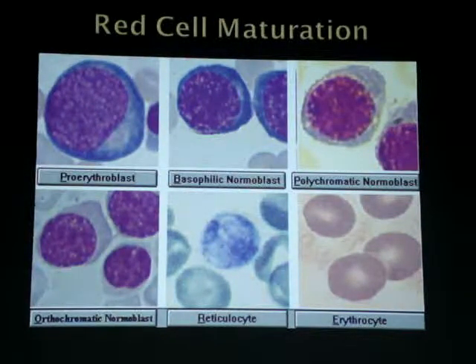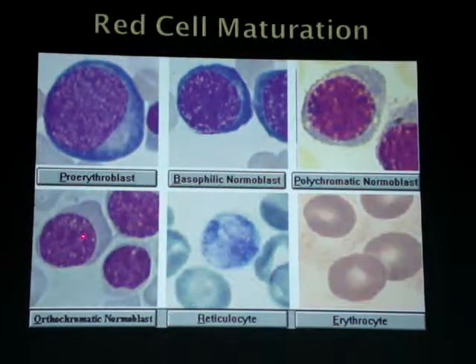The nucleus of the cells producing red cells is usually dark, and you will be able to see holes in the large dark nucleus. That cell usually belongs to the erythroid series. So this cell will have a large nucleus with coarse chromatin pattern, or a dark nucleus with nuclear holes.